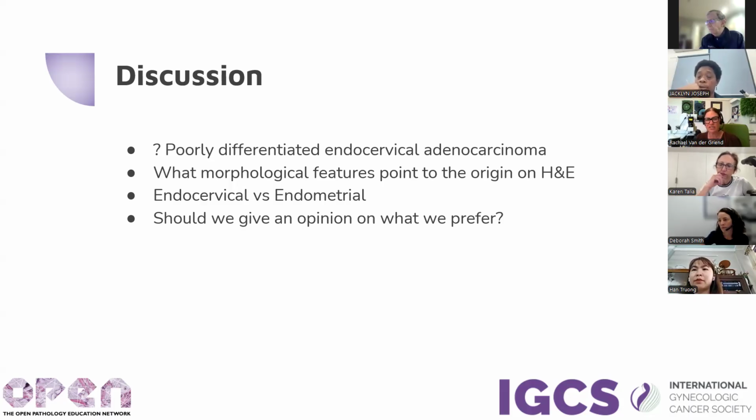Okay. I think there's a lot of apoptotic stuff as well as the mitotic figures, and I think that's quite helpful. That points me more towards a small cell rather than a standard endocervical adenocarcinoma. Whether that's valid or not, I don't know, but just an observation. Jacqueline, how big is it? What's the clinical staging? I think they said from yesterday that they were going to allow for the delivery to take place, which means that the clinical staging must be more than 2A.